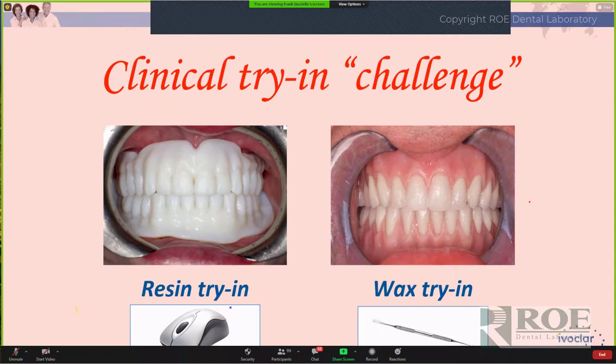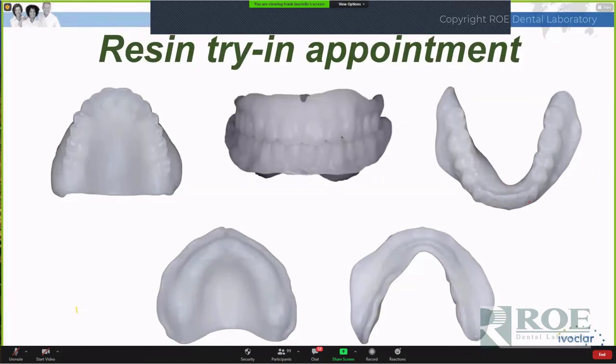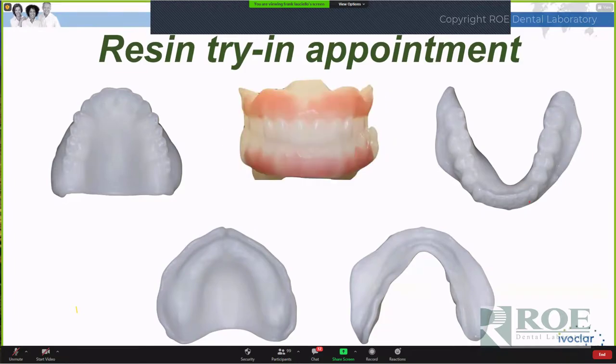But we could make this monolithic try-in denture look a little better by adding some pink wax or some triad material, just to show some degree of distinction between the teeth and the denture base. And at the dental lab, they'll have some suggestions for you to make the try-in a little bit prettier. With the printed versions, you might even be able to get shaded teeth to a certain degree, but that's what you'll work out with the laboratory.